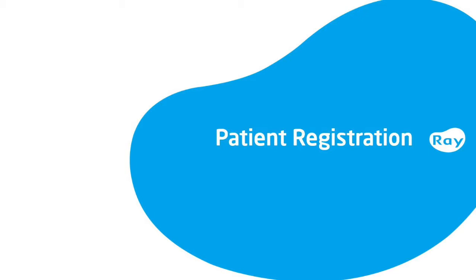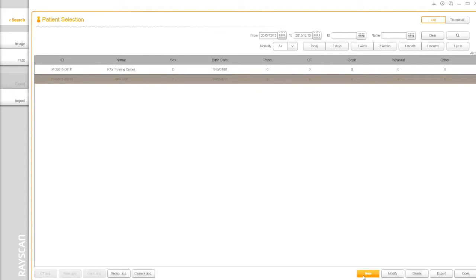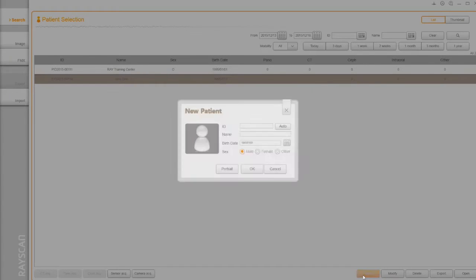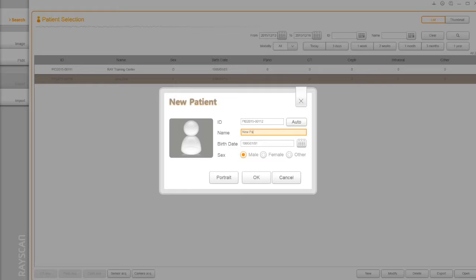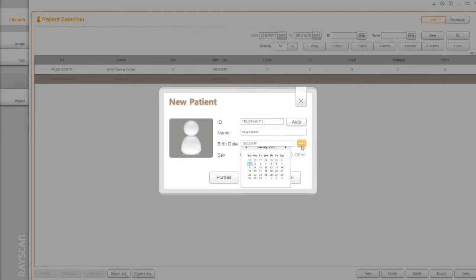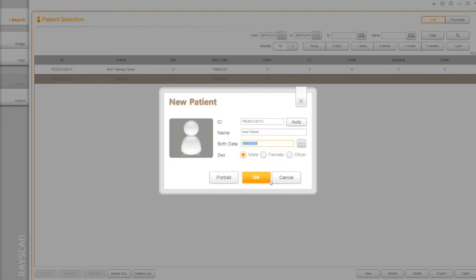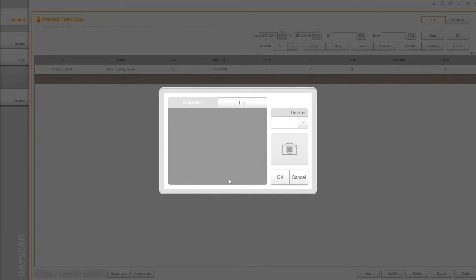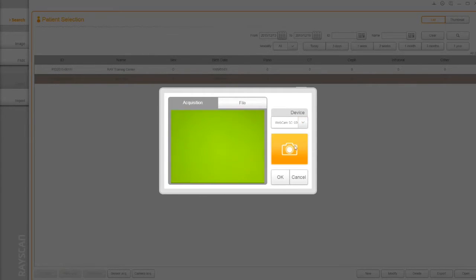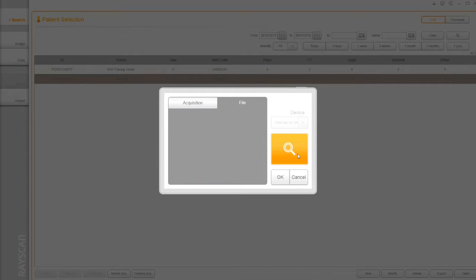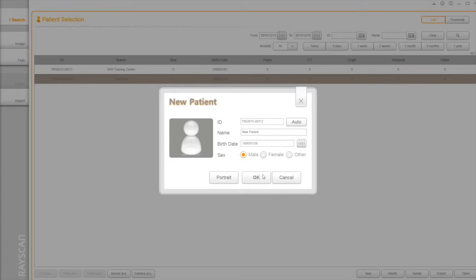Patient Registration. To register a new patient, click on New button. You can use the auto-generator or manually type your own number. Type the patient's name, choose the date of birth. You can take a picture of the patient or navigate the picture if you already have one.